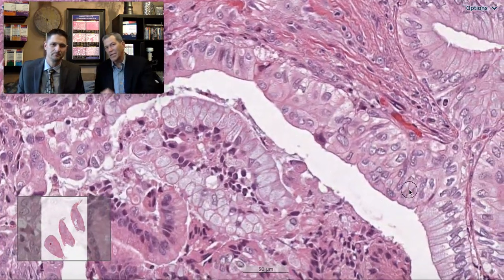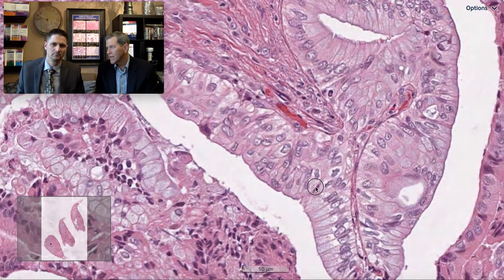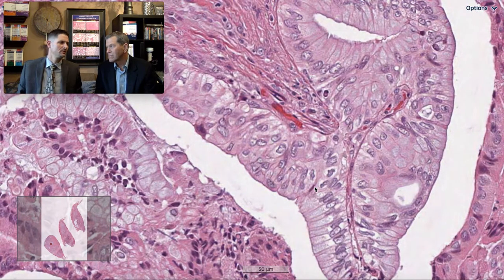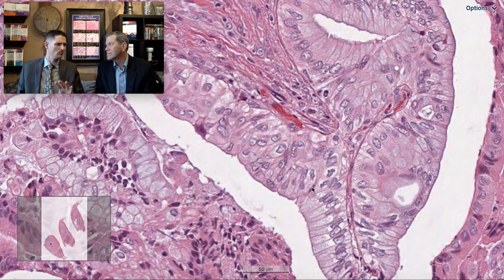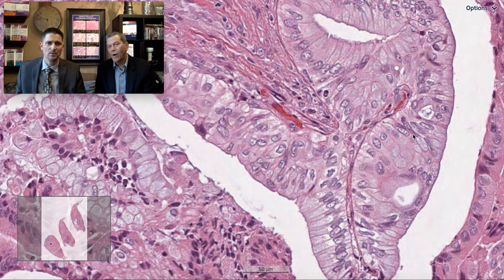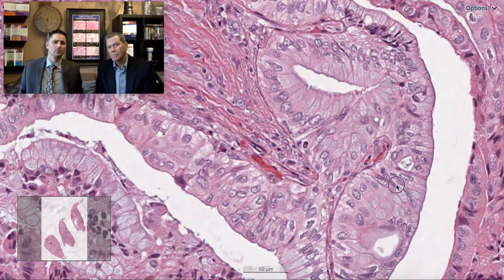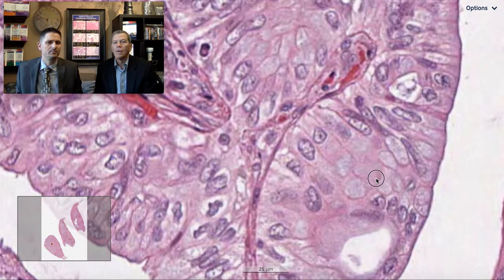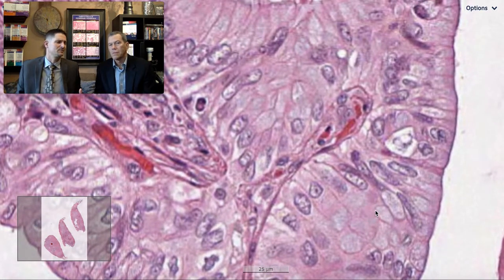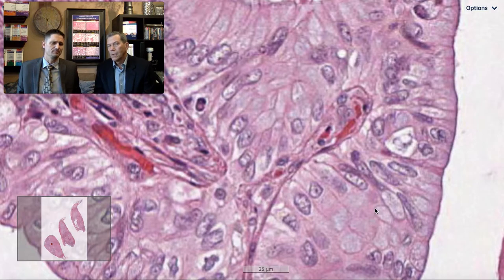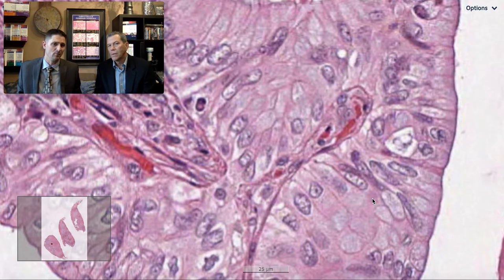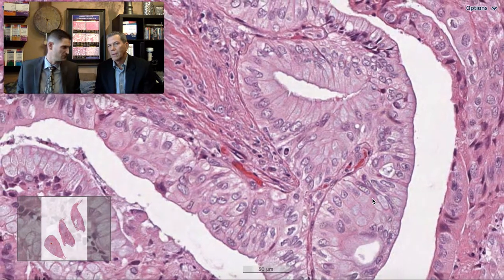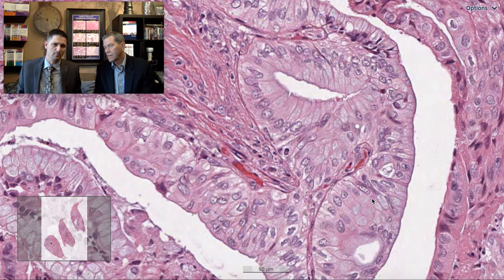Here we have entire strips of mucinous cells, one after another. If I got that in a transbronchial biopsy I would diagnose mucinous adenocarcinoma — it would be in a whole different setting without interstitial lung disease to consider. And here's even a cribriform structure. If we wanted to help calm the clinicians' fears and confirm our impression, we could do some immunohistochemical stains.